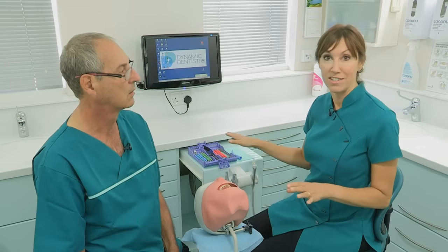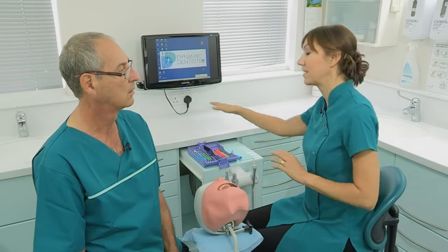If you as a team decide not to have the instruments on the dentist's side, then we have to be able to exchange our instruments in a very safe way, in a very efficient way, so that the dentist is just looking at the tooth and the nurse is able to pick the instruments up and hand them to him and retrieve them. Now, to do this, the nurse will have to have the instruments positioned within arm's reach. If they're any further away, it's going to just be very irritating for her to keep twisting, turning and leaning.